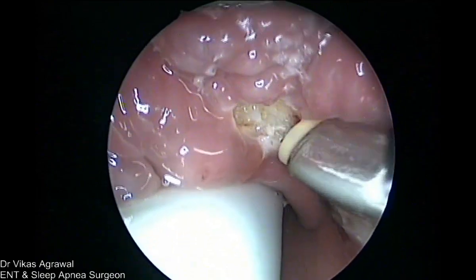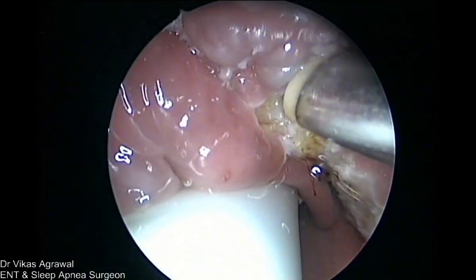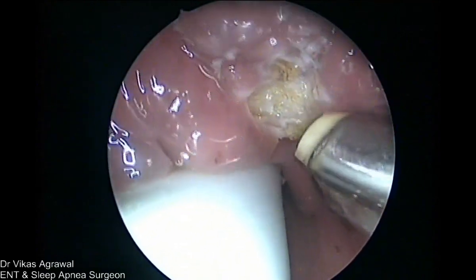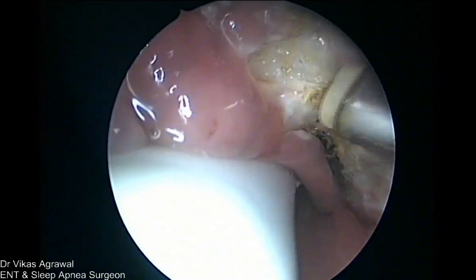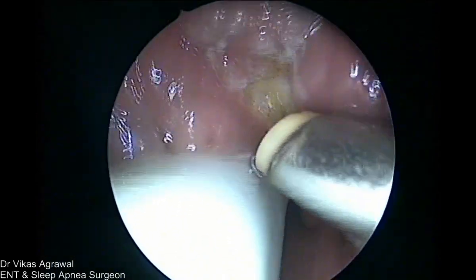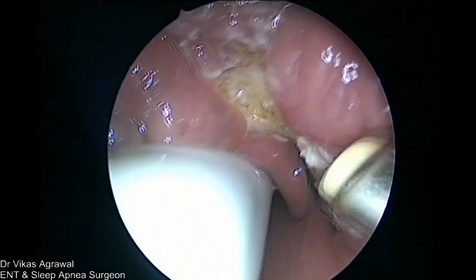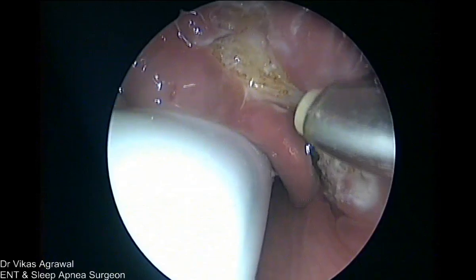The problem here in base of tongue is that you cannot coagulate the arteries at the back. You can only coagulate them at the tip, so they can always open up later. That's the reason you have to be really careful. This part need not be removed, because this is not causing an airway block.